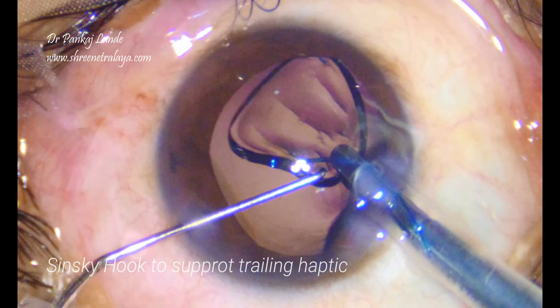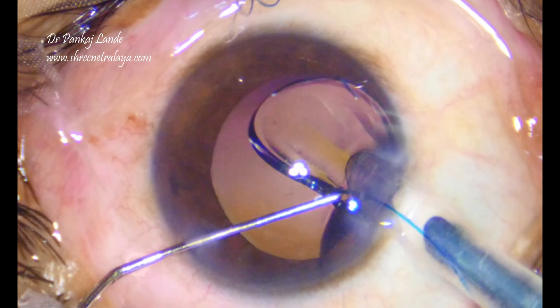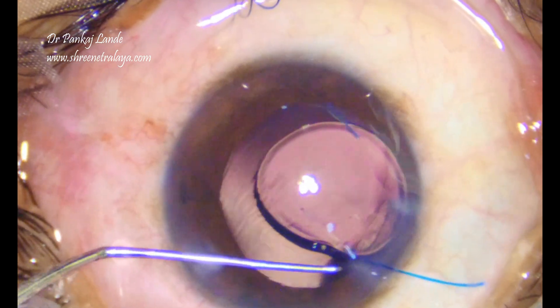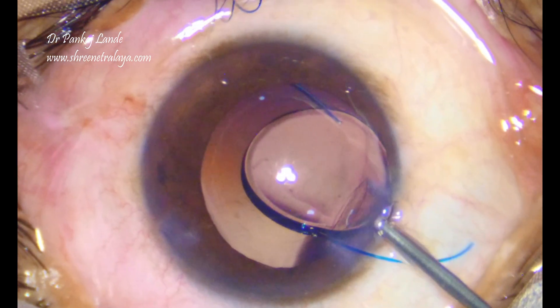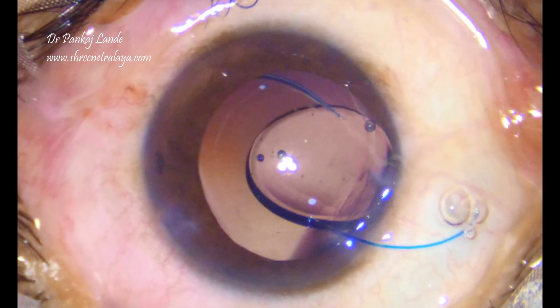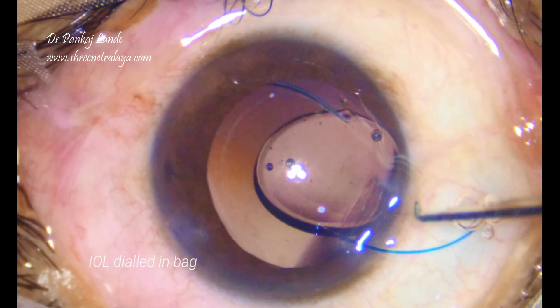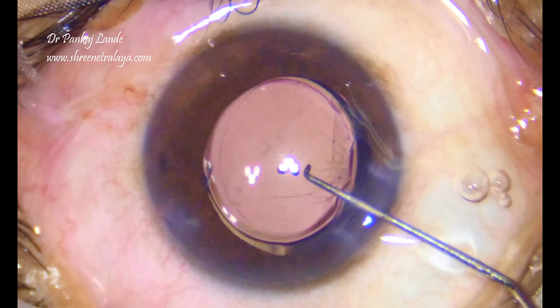While releasing the trailing haptic, you can support it with the help of a Sinski hook and then inject the IOL comfortably. Now the IOL is injected into the bag fully, and this completes the surgery.